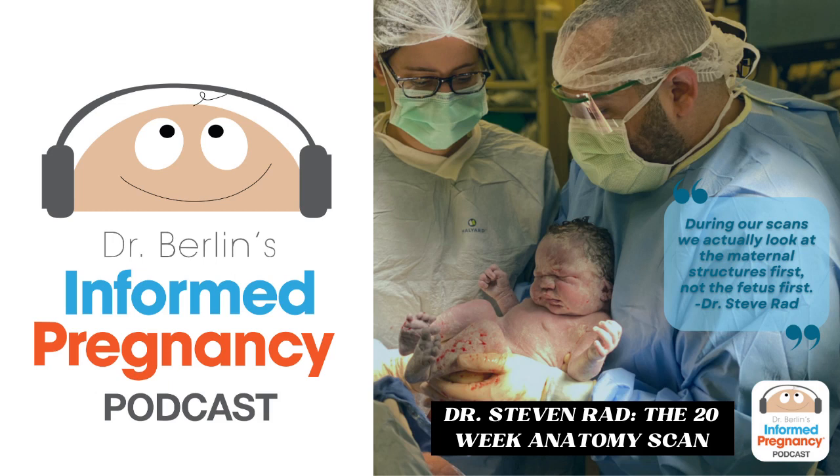Make sure the valves are looking good, making sure the arteries and veins coming off the heart and the structure, large ones, for example, that go to the lungs, or the aorta that takes blood to the upper body and to the lower body from the heart, and the veins that bring blood back to the heart. We look at all that. I'm going to make sure the blood vessels are crossing over each other correctly. There's a lot of details in the fetal heart, such that you can even be seen by a pediatric cardiologist and get a full fetal echocardiogram, either by a pediatric cardiologist or your maternal fetal medicine specialist may be trained in formal fetal echo. The heart is a complicated structure.